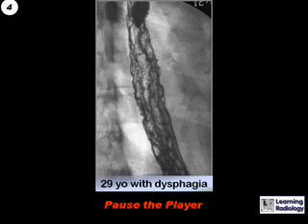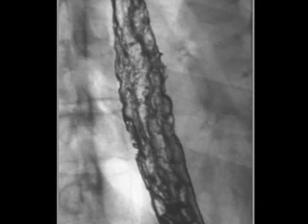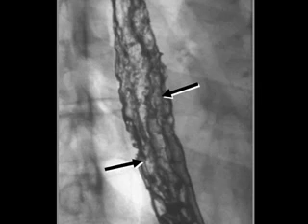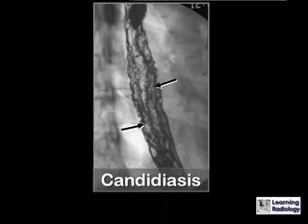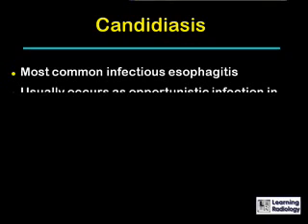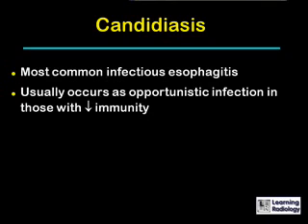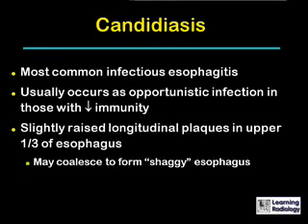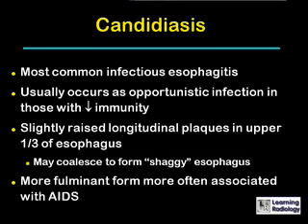The next case is an esophagram on a 29-year-old with dysphagia. There are multiple linear plaque-like filling defects, as well as plaque-like linear ulcerations, producing a somewhat shaggy appearance to the esophagus. This is the typical appearance for candidiasis of the esophagus. Candidiasis is the most common infectious esophagitis, usually occurring as an opportunistic infection in those with diminished immunity. It produces slightly raised longitudinal plaques, usually in the upper third of the esophagus, but it can involve the entire esophagus. These plaques may coalesce and form the shaggy appearance. The more fulminant form of candidiasis is more often associated with AIDS.